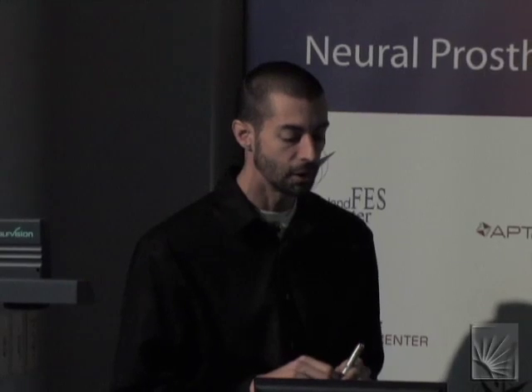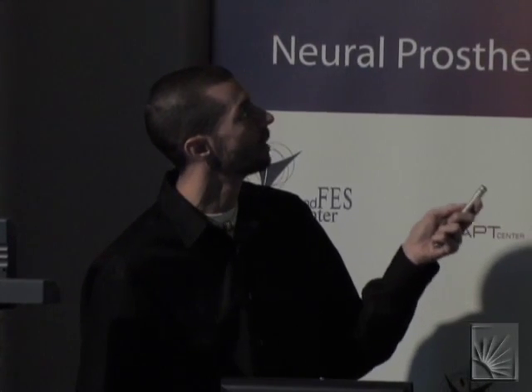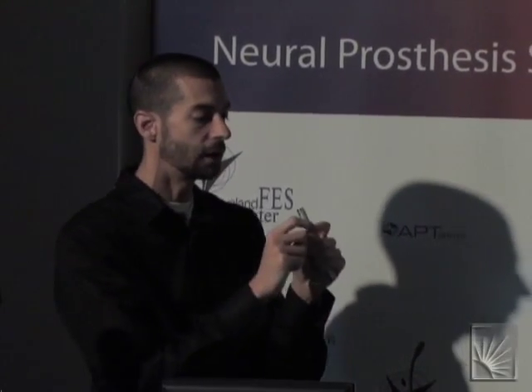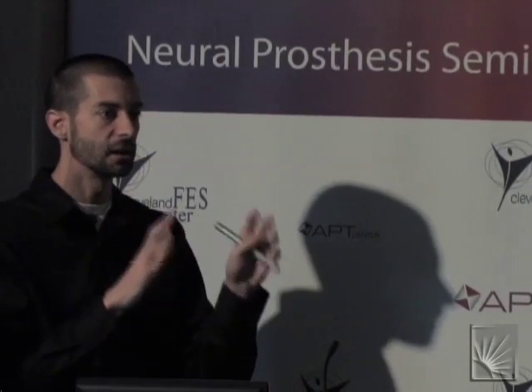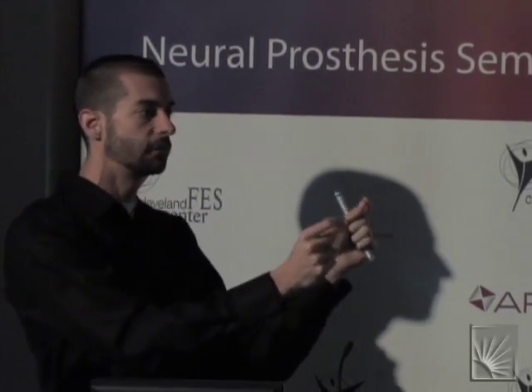But for the most part, using traditional techniques to scale a brain atlas to fit a patient, one of which is called AC-PC scaling, where you take the AC and the PC, which are 2 points in every person's brain, you can take an existing brain atlas that has an AC and a PC, and you can stretch it such that it matches that of that patient.